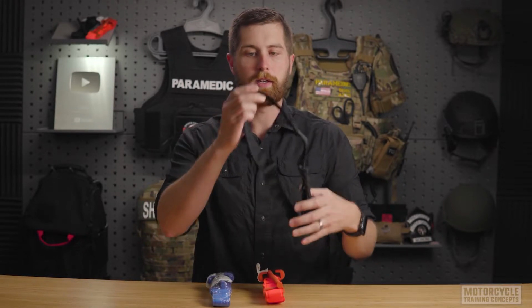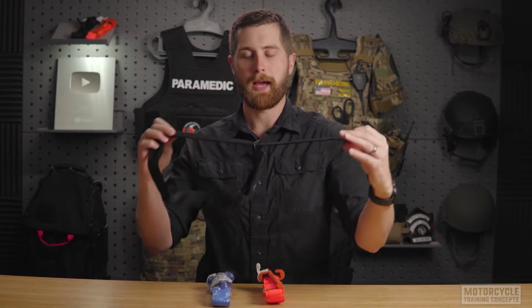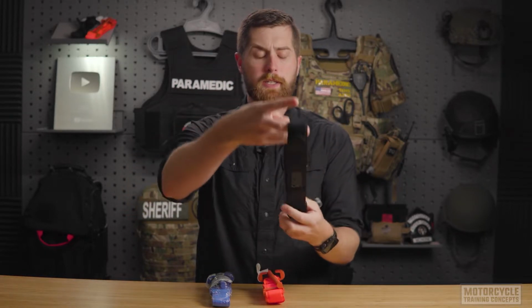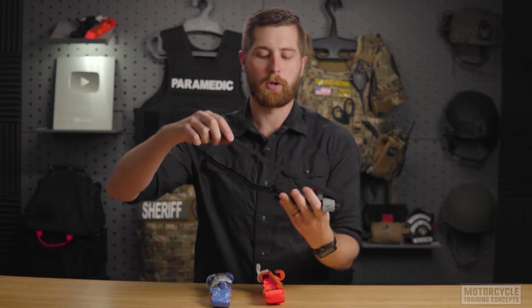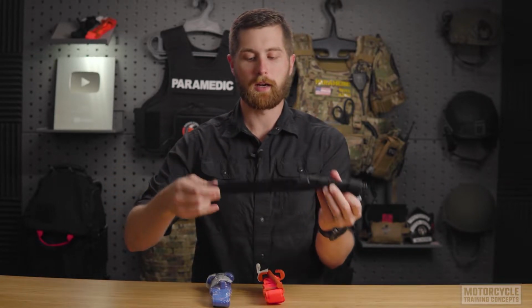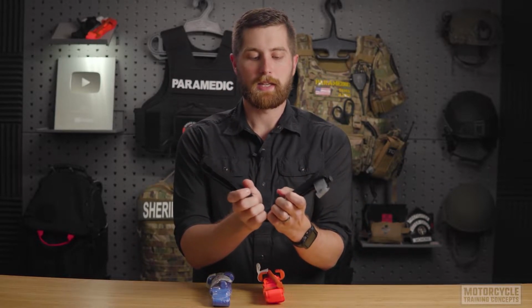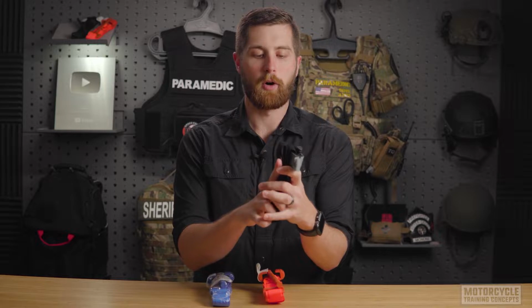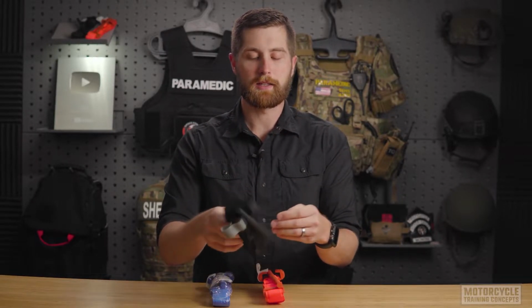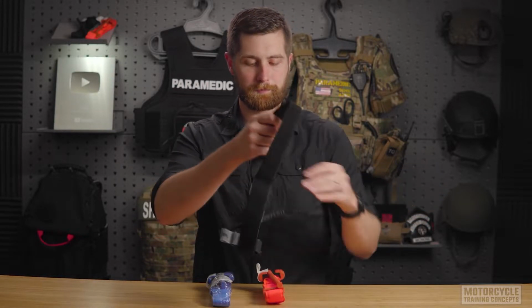So in this method, we'll take the tail and we want between 6 to 8 inches past the buckle. We're going to fold that in on itself. We're then going to take this tourniquet here and we're going to lay it down across the buckle so the Velcro is facing up and this is facing the windlass. We can take this and we're going to fold it again in on itself, almost like an accordion fold. And what that'll allow me to do is take this, if my arm is injured, and I can put this on me, pull that tight.